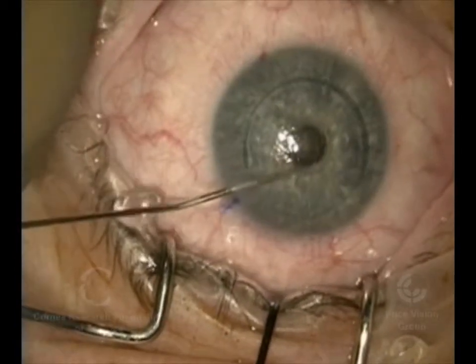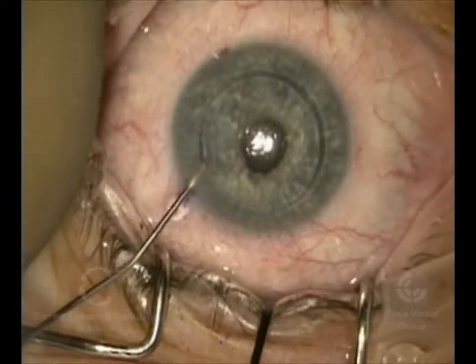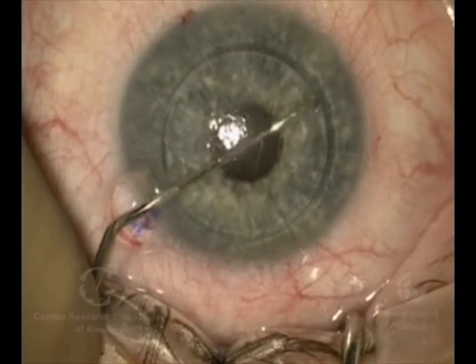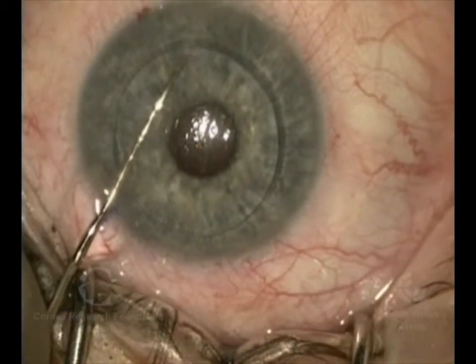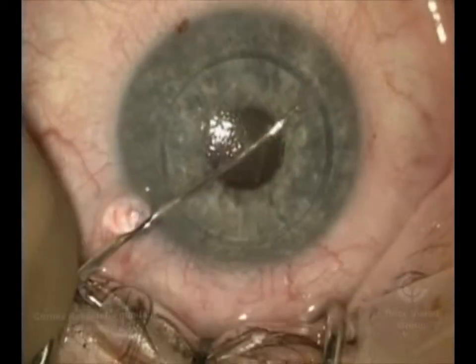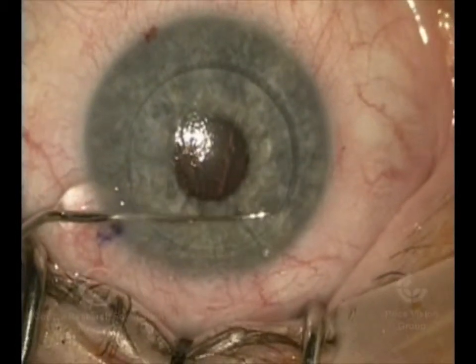Now, just like the other ones, we're going to make the incisions, but here we're putting a gooey material in the eye called viscoelastic. We do that after we inject the anesthetic agent. As in the other ones, we're going to score Descemet's Membrane and then strip it out, but we're doing this with the viscoelastic in the eye.